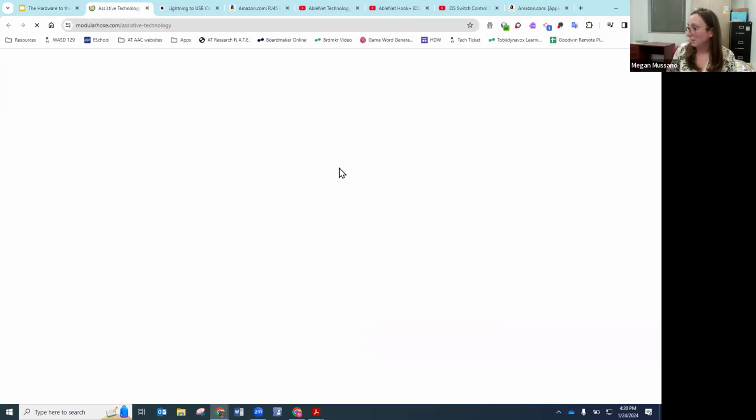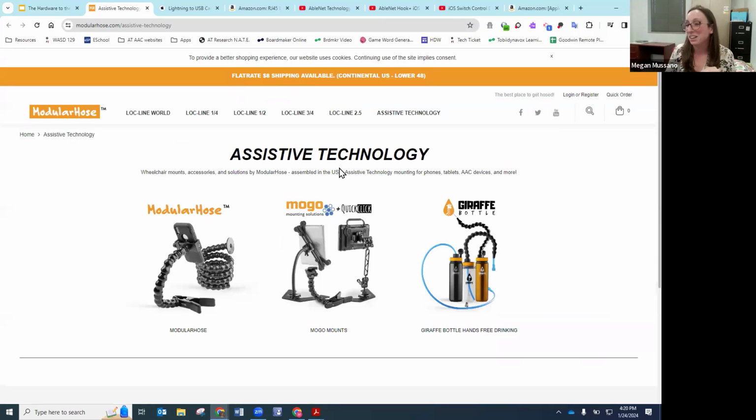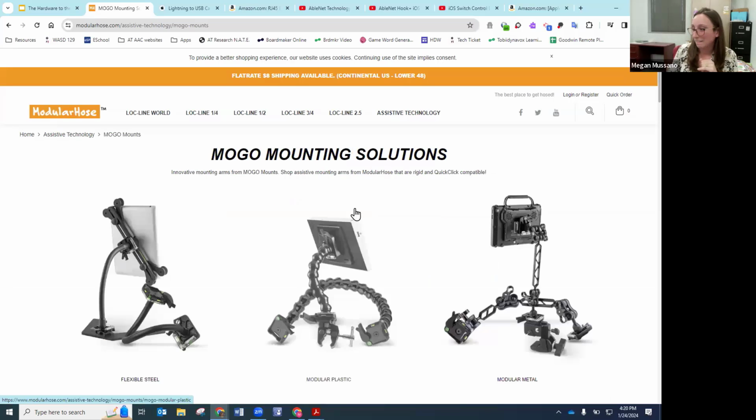I know we're going to get some yeses or nos. Has anybody ever tried this? Anybody in the audience gone to this before? Oh, that's okay. As you can see, right here, here's that real hard clamp one.